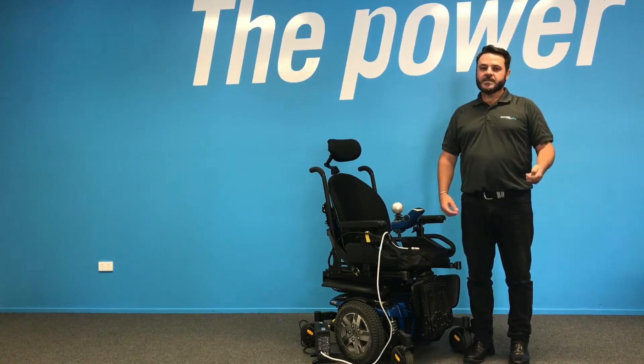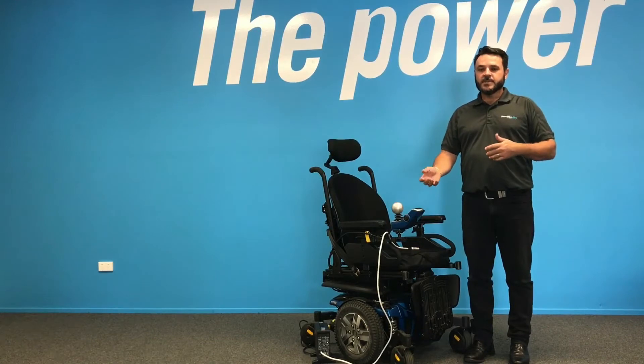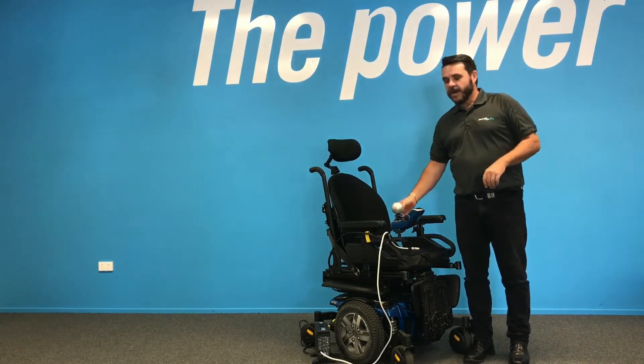In the first couple of weeks — say 10 to 12 days of operating your new power chair or scooter — the batteries shouldn't discharge below 30%. So don't put them under excessive load; do light trips and ensure that you're charging them after every use, just to make sure that you get the maximum amount of life out of your batteries.